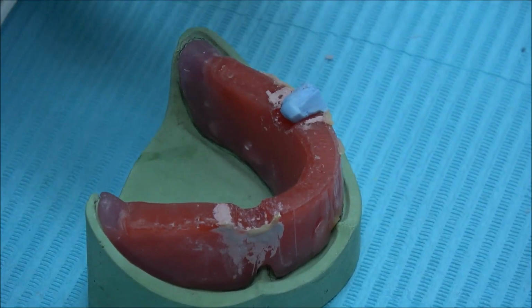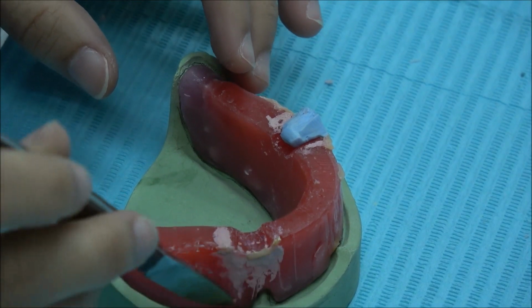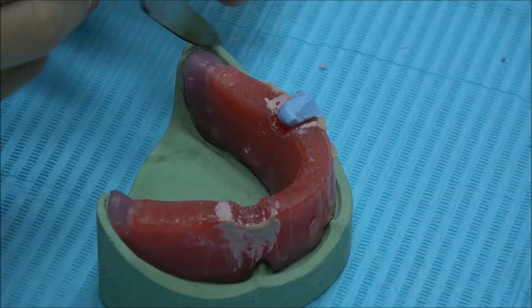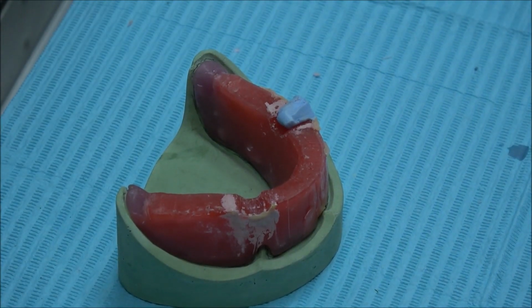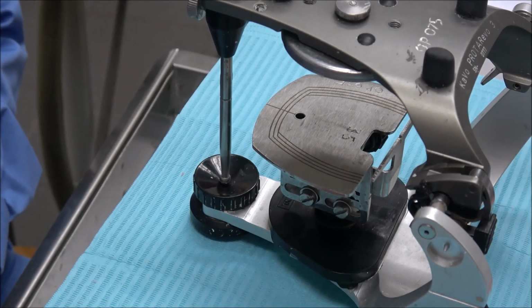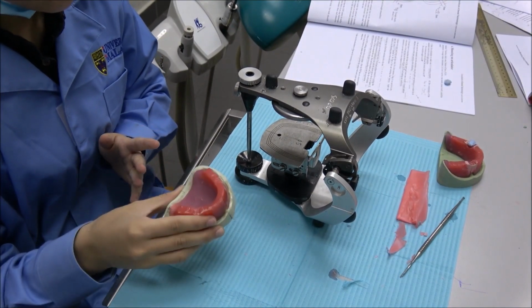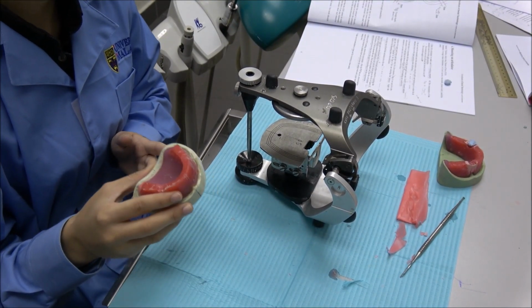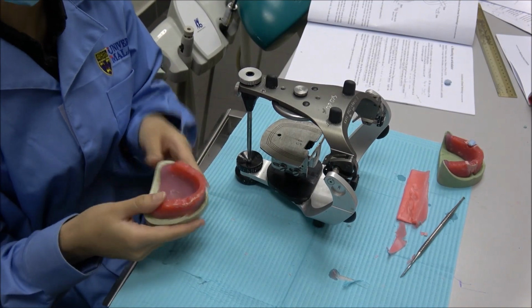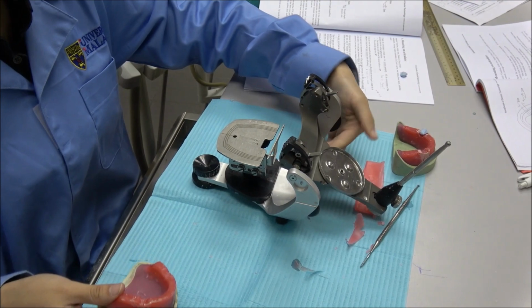Okay, same as the lower models, we will seal it around the sulcus before we proceed. Okay, same as the upper models. Come back to our upper models after we seal the lower models. So after we seal, we have to place it on our occlusal table. So here is our occlusal table.